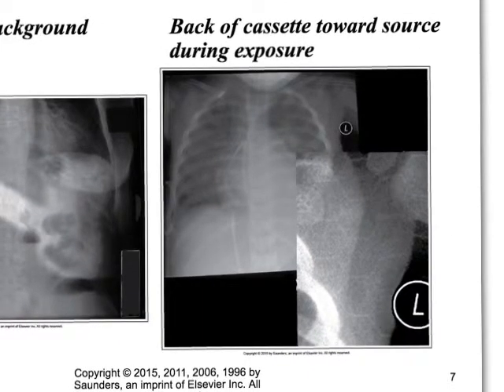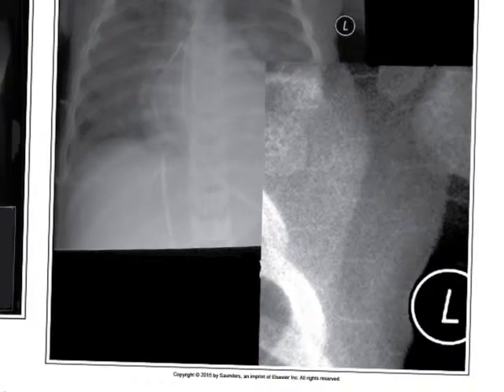Here is the back of the cassette. So this image was acquired with the cassette backwards, right? And I can even tell you this is probably an AGFA cassette because it has that plastic pattern, that reinforcement pattern inside the plastic is hexagonal in shape. Can y'all see this on the overhead, these little hexagons here? We shouldn't be seeing that.